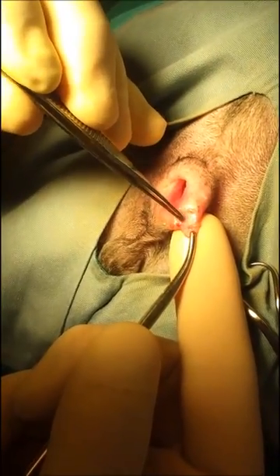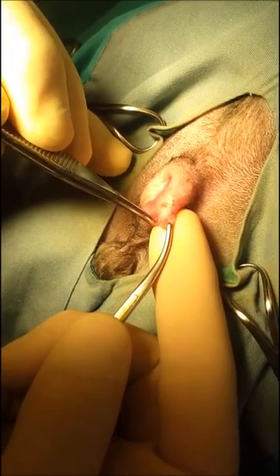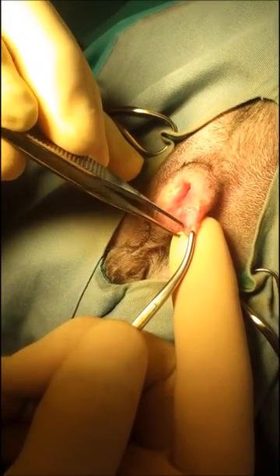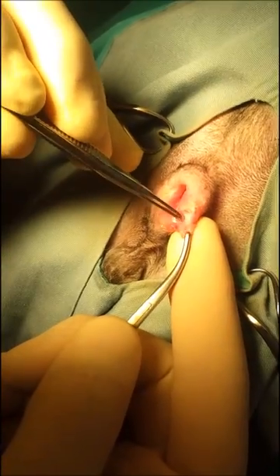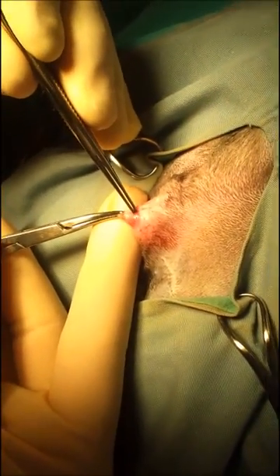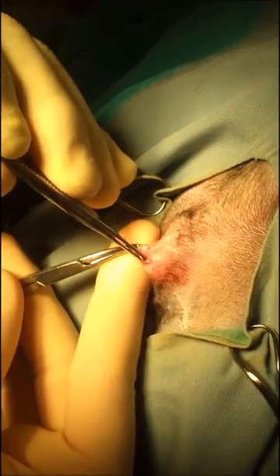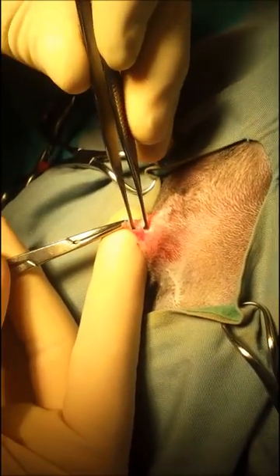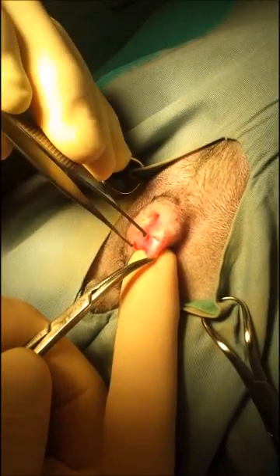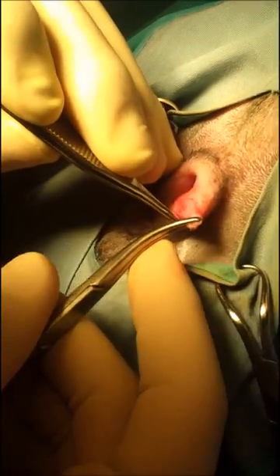That's the gland there. But depending on the blood pressure of the animal, that white glistening tissue could be muscle. So you want to dig a little deeper — see all that muscle there? That's all muscle. You don't want to include that in your excision. You want to push all the muscle away from the gland.